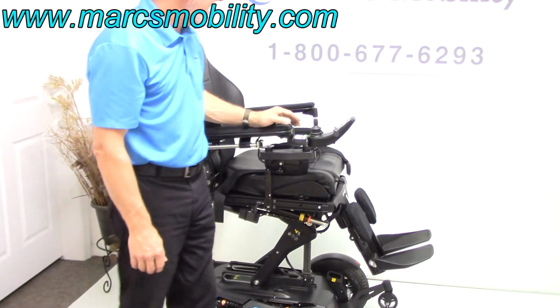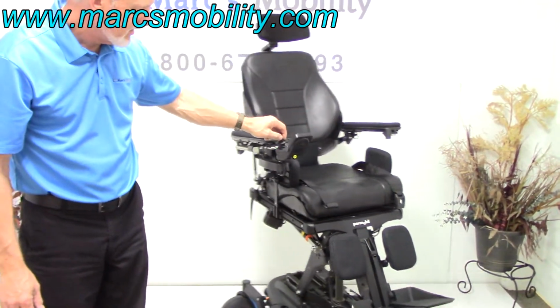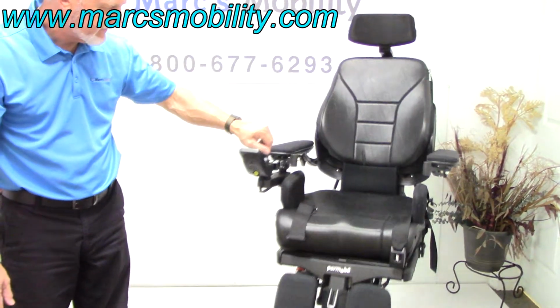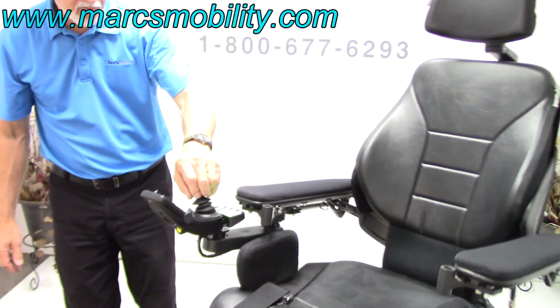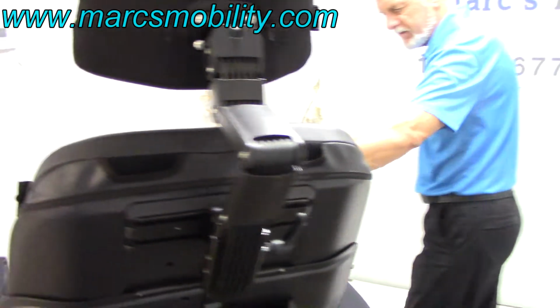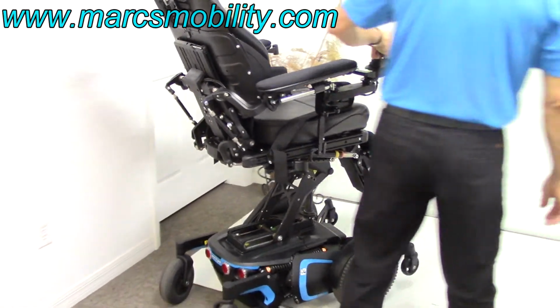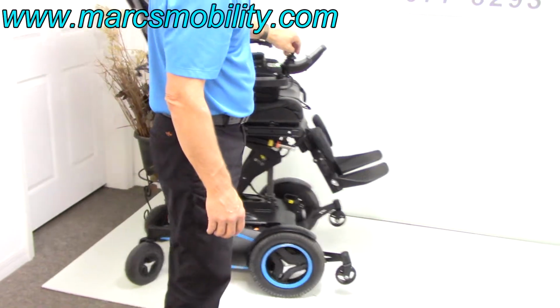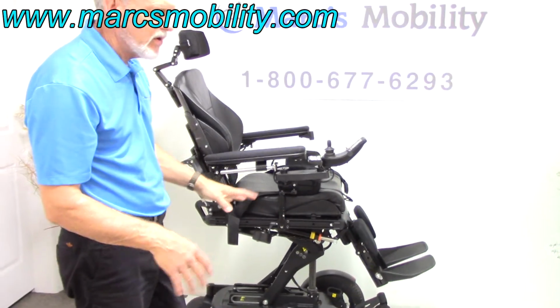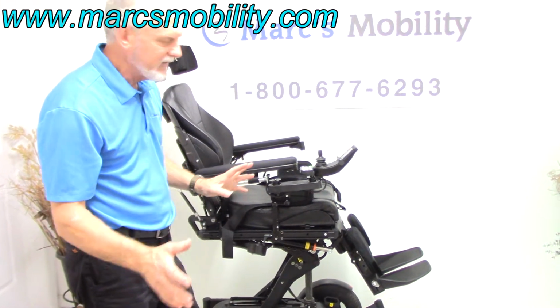There we go. And as I said, the chair will still drive with the seat elevated. It'll drive at 1 or 2 miles an hour, so it's not going to drive at full speed, but you'll still be able to drive with the seat elevated. Now, if you're going to drive with a 14-inch seat elevation up in the air, make sure you're doing it on flat surface. Don't go outside where it's really rough in the yard. You're just asking for trouble.